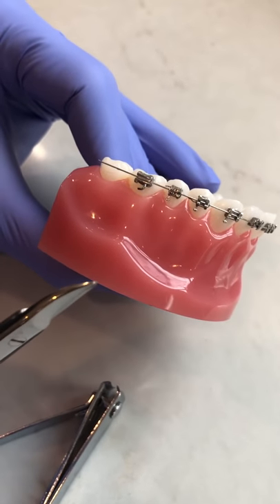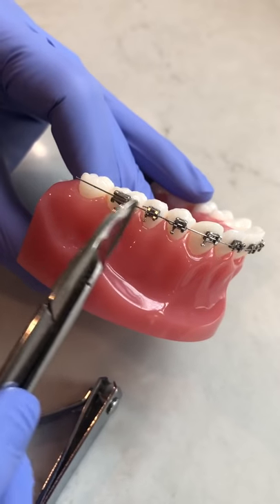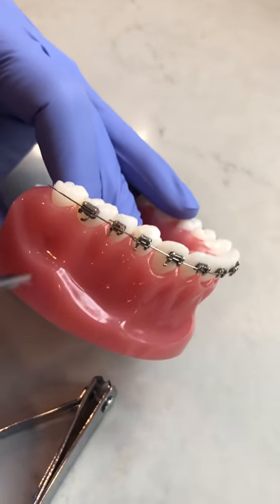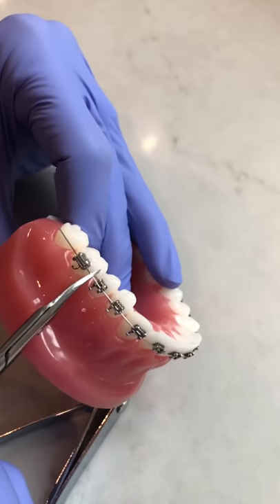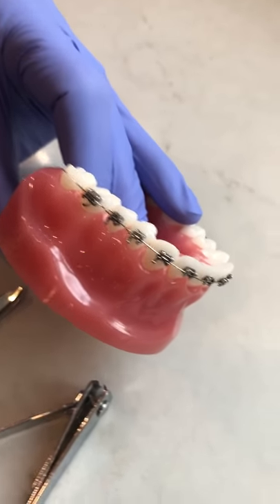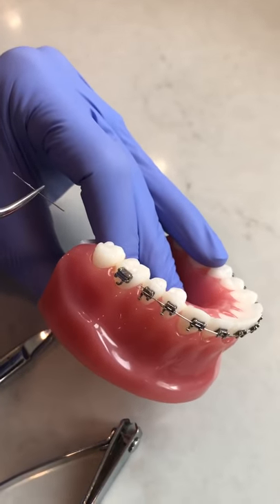It's going to be too hard to clip all the way back at the wire, so choose a spot between two braces or even forward to clip between. You can aim to pull between the back two if that's comfortable for you and then clip. That little piece of wire can then be removed forward or back with a tweezer — you just pull the wire out.